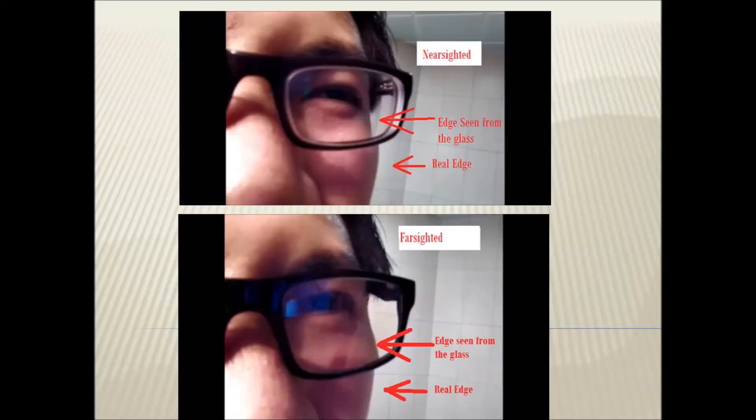In an instant, you can easily distinguish a farsighted from a nearsighted glass. You just need to focus your attention on the outer part of the frame, where you can see the edge of the face of the patient.